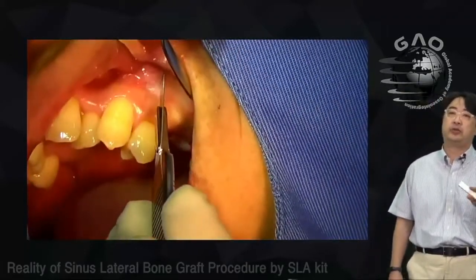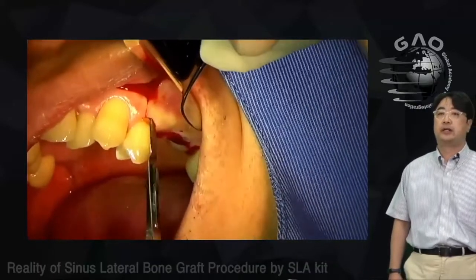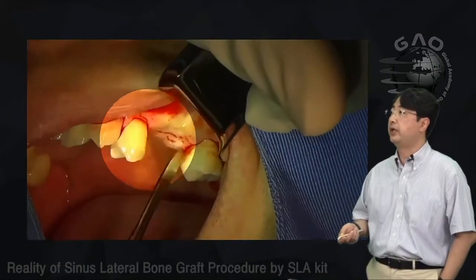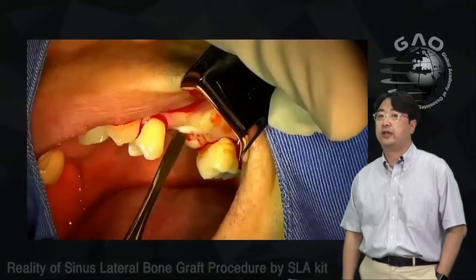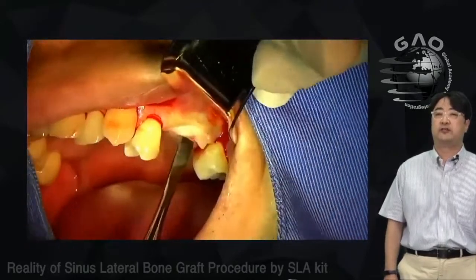I made a crestal incision and one vertical incision on the front tooth at number 24.